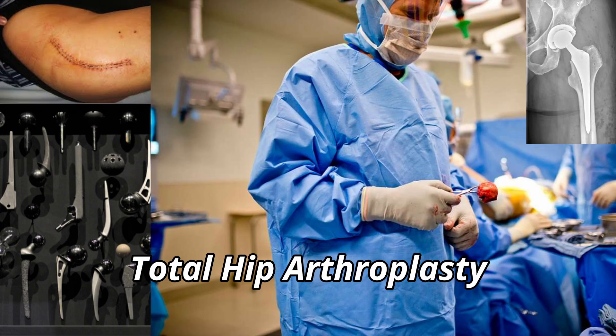Pitfall: Undersizing the femoral component increases fracture risk and poor fixation. Confirm canal fill and torsion alignment before committing.